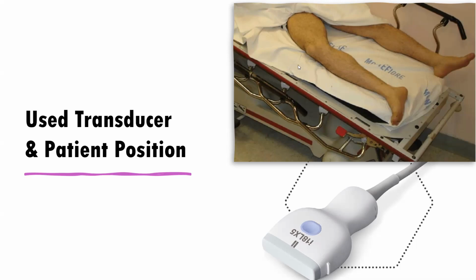It is better if you allow the patient to wear loose garments, so that you can scan comfortably, because you need to go up from this level, and if there is an obstruction here, it is not possible to scan comfortably.